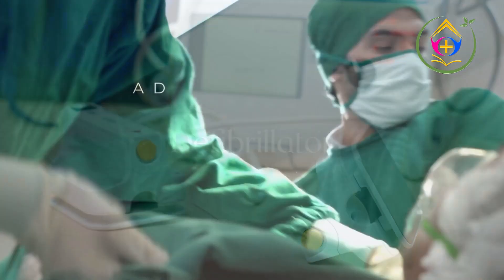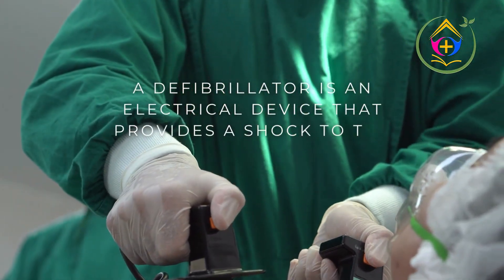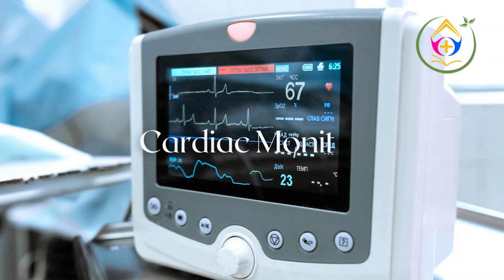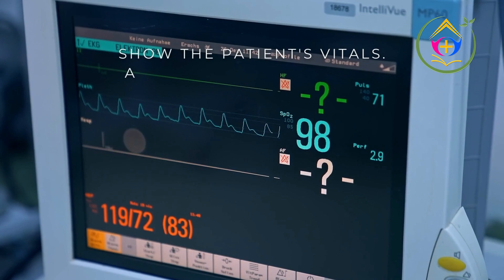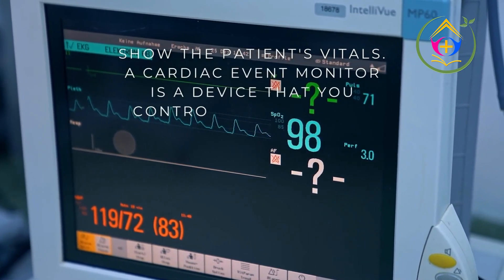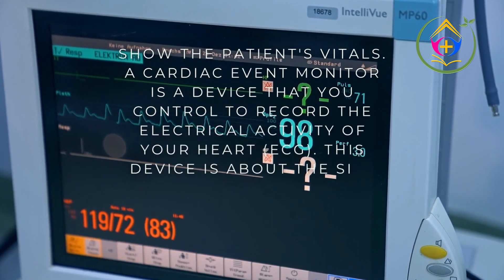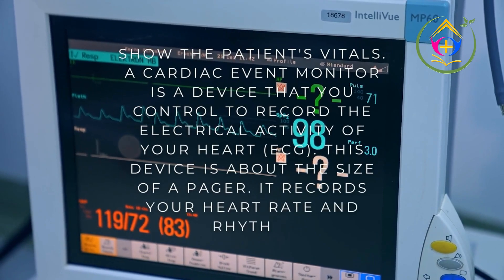Defibrillator: an electrical device that provides a shock to the heart when there is a life-threatening arrhythmia present. Cardiac Monitor: shows the patient's vitals. A cardiac event monitor is a device that you control to record the electrical activity of your heart (ECG). This device is about the size of a pager and records your heart rate and rhythm.